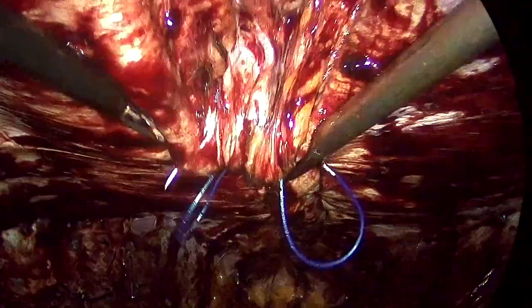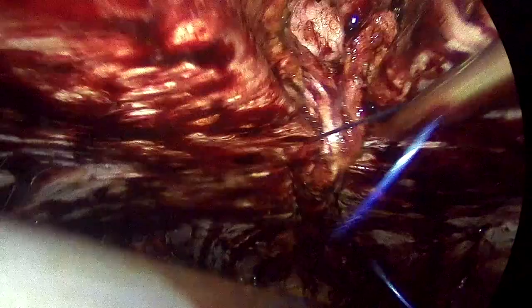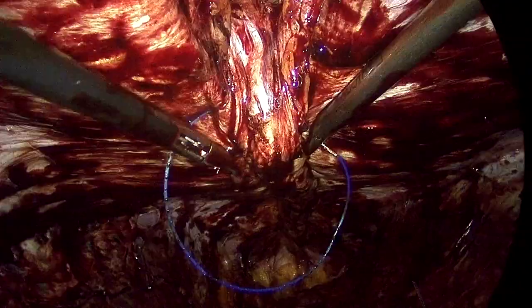This I learned from my friend Igor Veliansky. You can see both rectus muscles being re-approximated, and you can see how the defect and the fascia that has not yet been re-approximated is still bulging to the outside of the cavity.